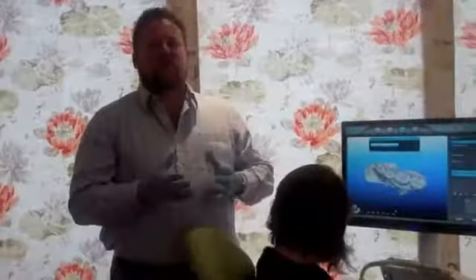Right here. Close together. Bite together. What are you doing now? It's just taking a digital bite record. Scanning finished. So that's it done. So if we sit Jen up, the computer's going to use an algorithm to smooth out, remove things like my finger, or if there's a little bit of cheek involved, and then it will make us a virtual cast that we will then be able to show you.